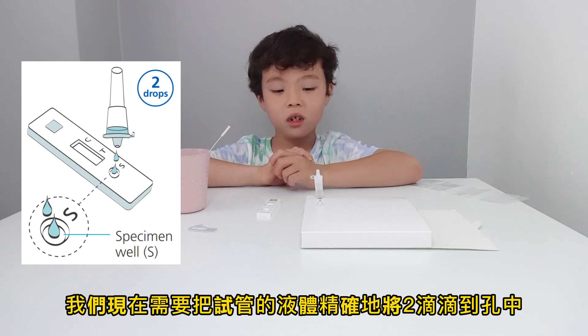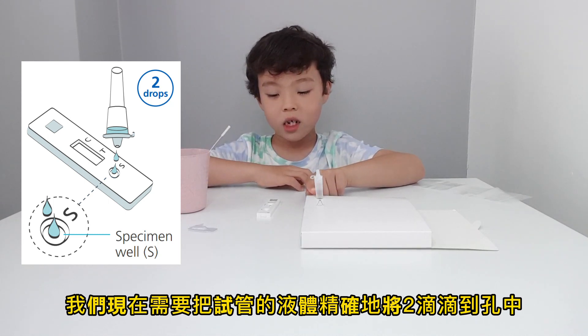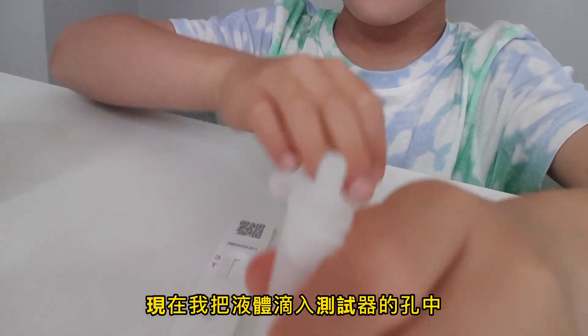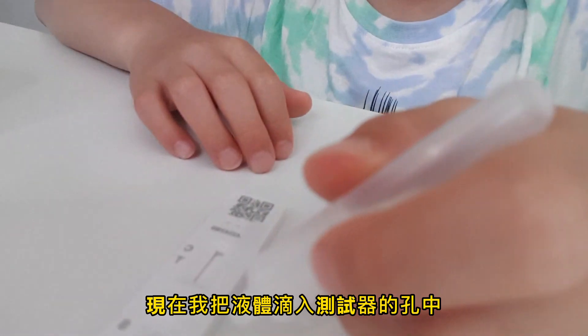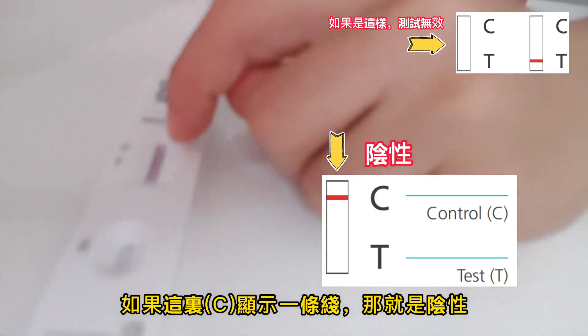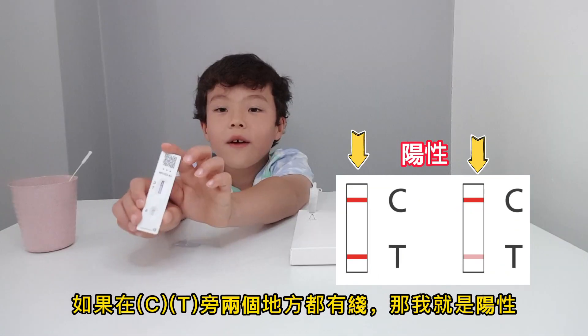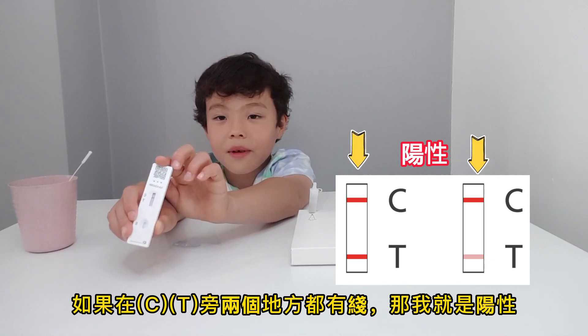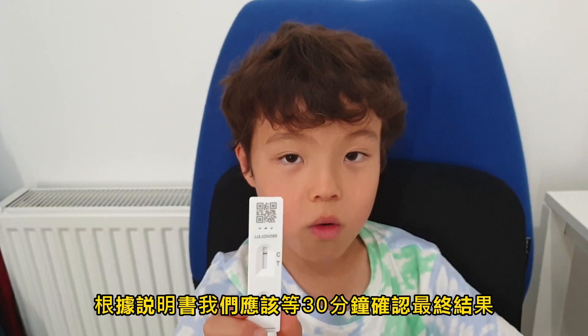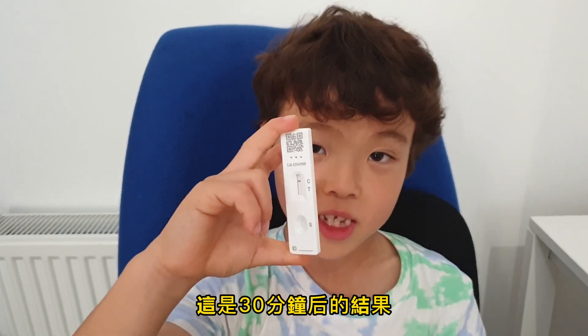Now we need to squish the liquid in the extraction tube into this specimen well where it says S. If there's one line here, that means I'm negative. If there's two lines next to C and T, that means I'm positive. Let me put this inside the waste bag. According to the instruction book, we should wait for 30 minutes to see the final result. After 30 minutes, this is our final result — it is negative.